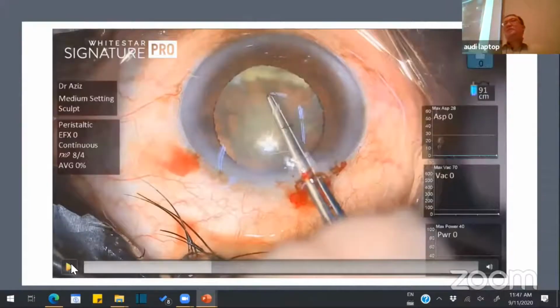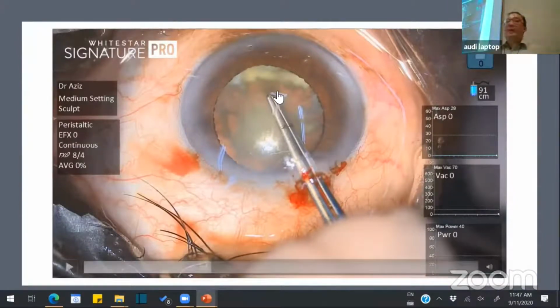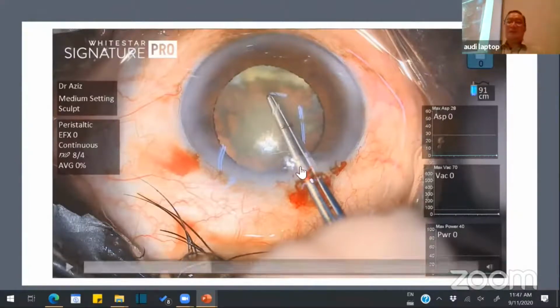So when people use a bent needle, I don't say it's wrong. I don't say to my trainees, please undo that. Follow whatever I say. Right? I don't do that. I don't undo them. Let them do whatever, but I will groom them from whatever they have, right? So groom them until they understand why, and then automatically they will just do this with the Utrata.